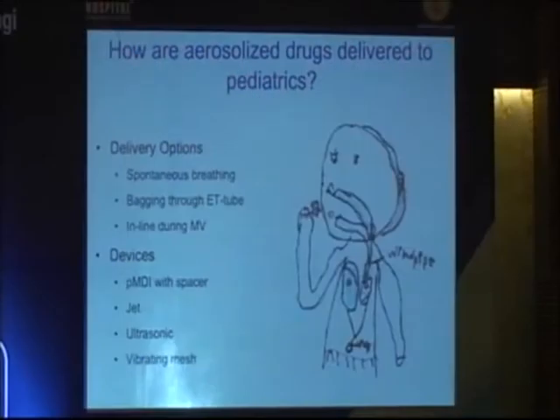So we know what types of drugs that we're going to provide to the patients, but how are we delivering them? Well, there's a number of different ways that we can provide aerosolized drugs. And for those of you that are just entering the room or who have tried to figure this all out in the past, an aerosol really is just a suspended particle in the gas stream. Okay, and that aerosol particle is going to be larger than the humidity or the water vapor that I was talking about earlier. All right, and depending on the particle size, that will determine where exactly that particle is going to deposit in the lung.